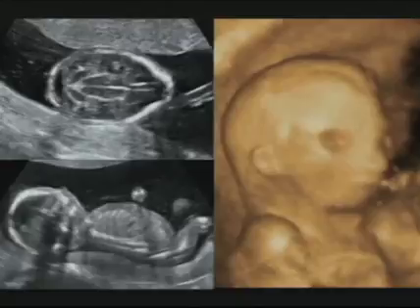Another dysmorphic fetus. This fetus has a neural tube defect, and I'm sure you guessed right, even though I'm not showing you a picture of the spine. What I am showing you is a picture of the head with a pointy head known as the lemon sign. This looks like a lemon. And I can also show you that the cerebellum is wrapped around the brainstem, and it looks like a banana, and that's the banana sign.